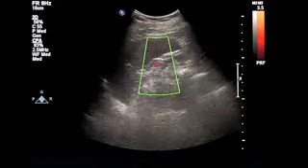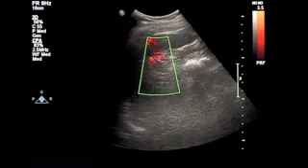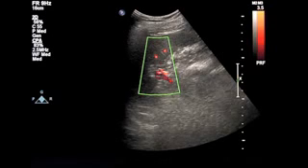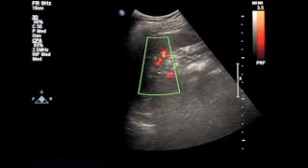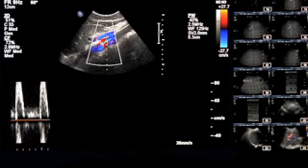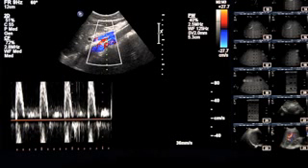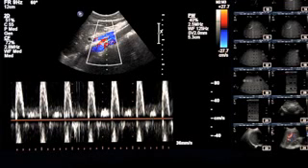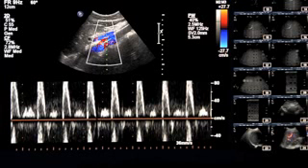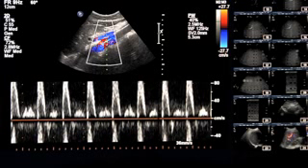Power Doppler is more sensitive than conventional color Doppler for the study of small vessels which have low blood speeds, as it overlays Doppler information on a grayscale image and just shows the energy within vessels. It can also be used when unsatisfactory color Doppler images are obtained, as it is less reliant on the correct angle of incidence of the transducer to detect a Doppler shift.